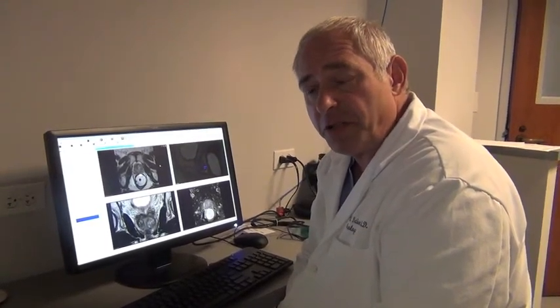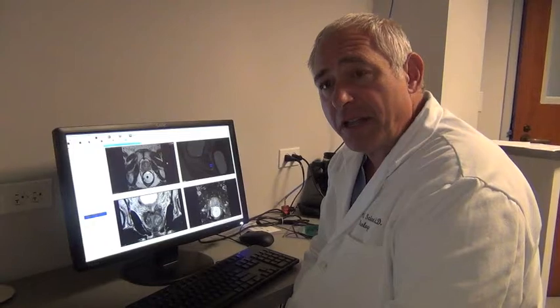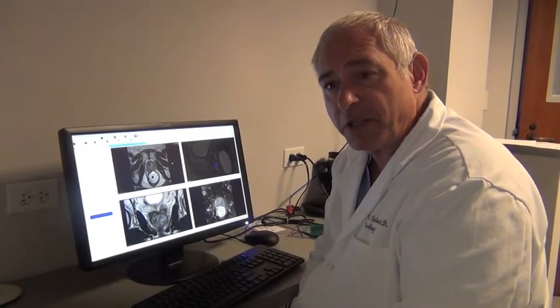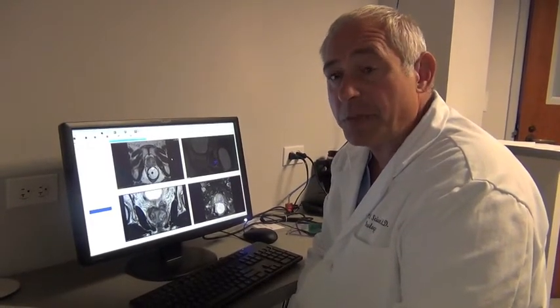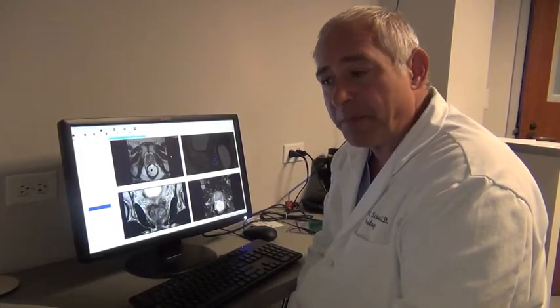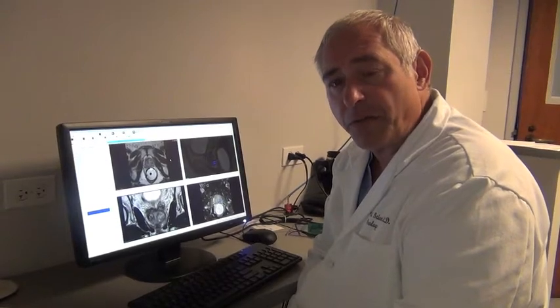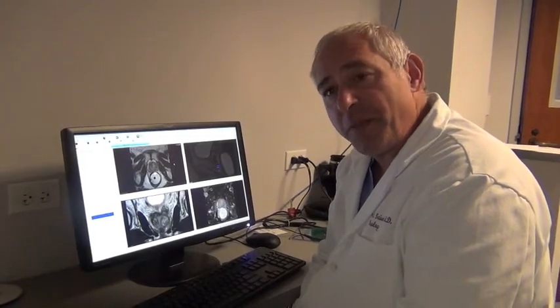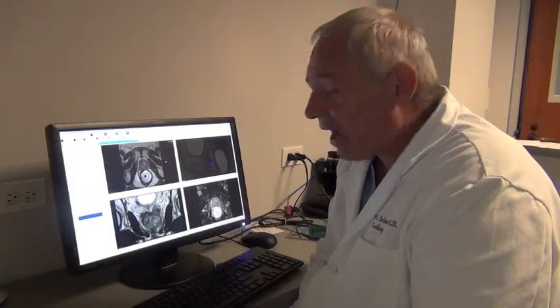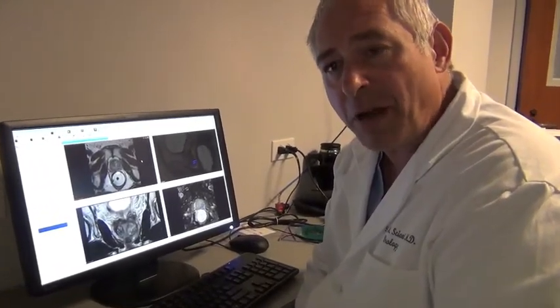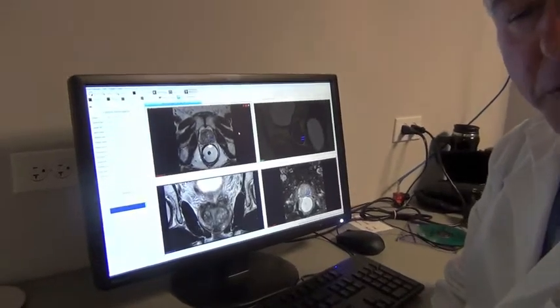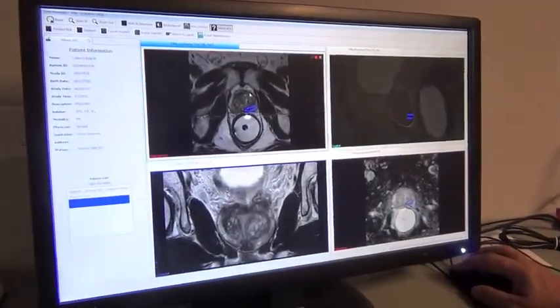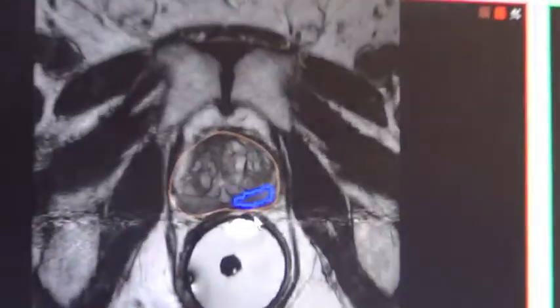The first step in a prostate fusion biopsy procedure is to evaluate the MRI images. We've got an excellent MRI team that supports this project, in which the radiology team has really taken advanced training and learned how to do a prostate-specific, multi-parametric prostate study. The radiologist has given me an indication in his report of where he suspects the most significant abnormality to be. I've loaded the images into the workstation software, and we've outlined the prostate — that is, we've segmented or outlined the prostate dimensions in both the transverse, the longitudinal, and the coronal plane. You can see the brown line here is a segmentation or outline of the prostate.